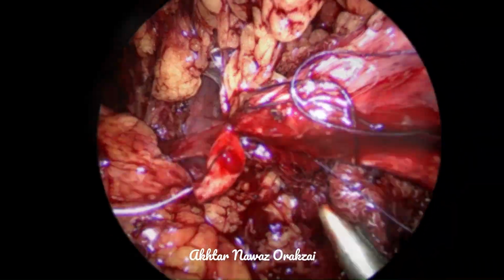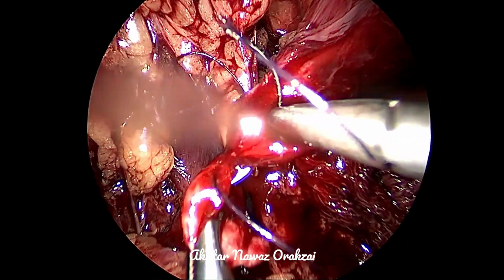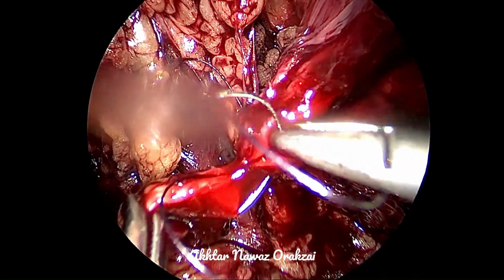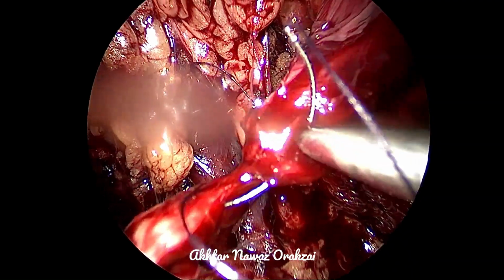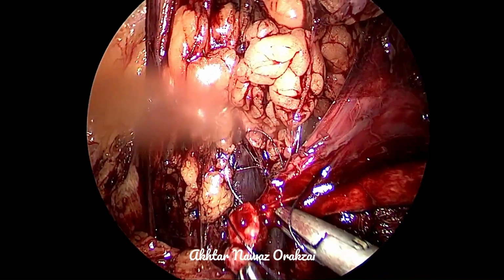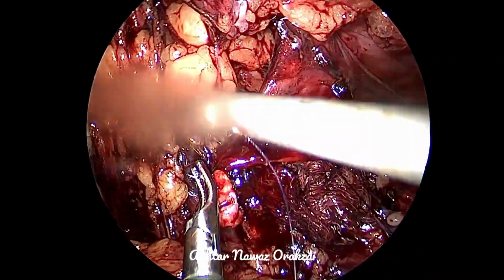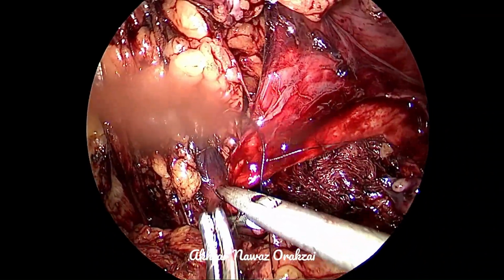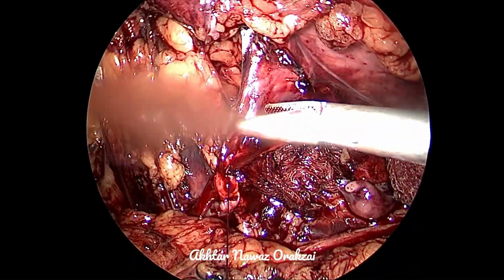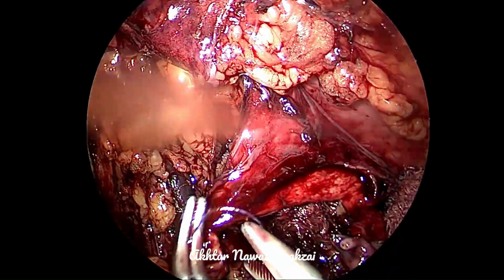And now we start the anastomosis of the posterior wall, what they would call in open surgery the posterior wall. So initially, in a few stitches, very accurate margins of the ureter need to be taken into the stitches. Mucosa to mucosa approximation is really very necessary for it to be watertight.